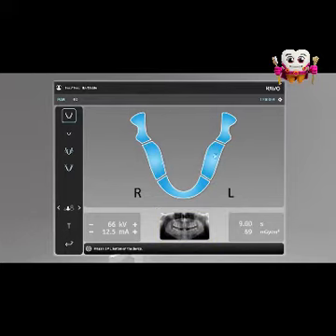The patient size indicates the currently selected patient size. Press the patient size selection icon to open a list of patient sizes: small, medium, and large. Select the patient size icon to activate it. Selecting a patient size adjusts the kV and mA to preset levels. Manually adjusting kV and mA according to the patient's size and skull anatomy is also an option and can be accomplished by selecting the minus and plus icons.